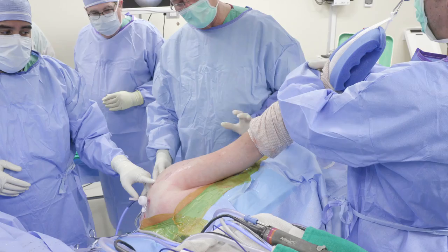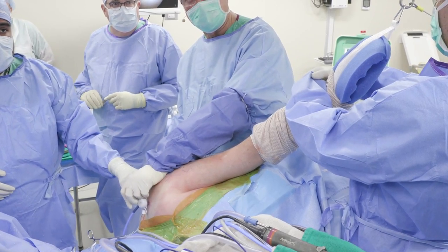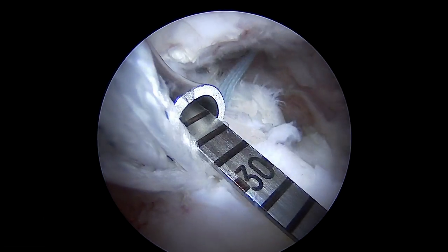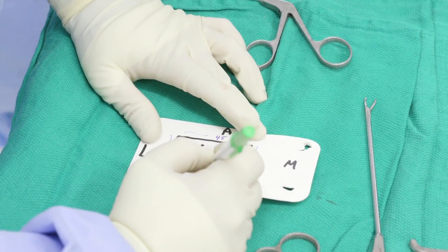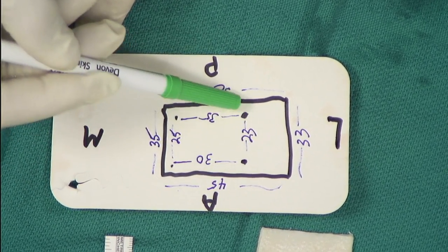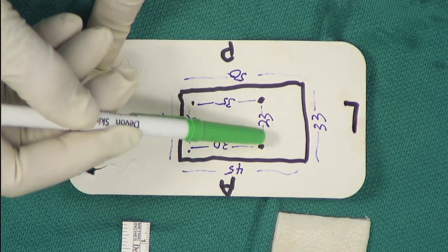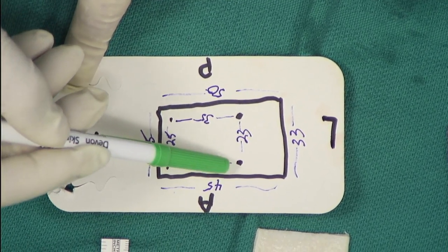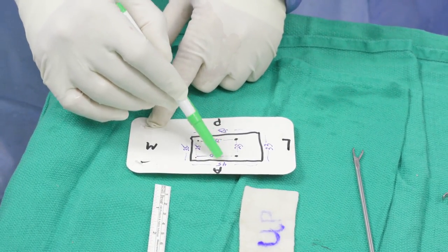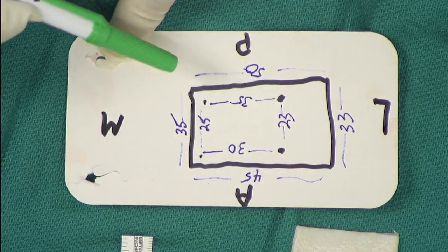Before we measure for our graft, we should be sure the arm is in the correct position to adequately tension the graft — about 20 to 30 degrees of abduction and 20 to 30 degrees of forward elevation. As I measure between the four anchors I call out the measurements to my assistant, who marks them on a template on the back table. The measurements are: 25mm between the medial anchors on the glenoid, 23mm on the lateral anchors on the humerus, and then 30 and 35mm anterior to posterior. I use a 5mm flap of tissue all the way around — anterior, medial, and posterior — except laterally where I use a 10mm extra flap so I get better coverage on the greater tuberosity.